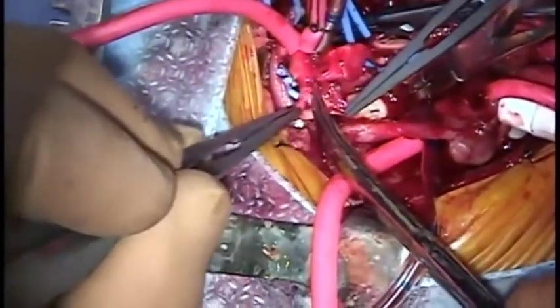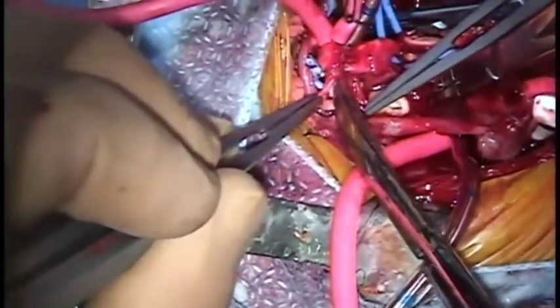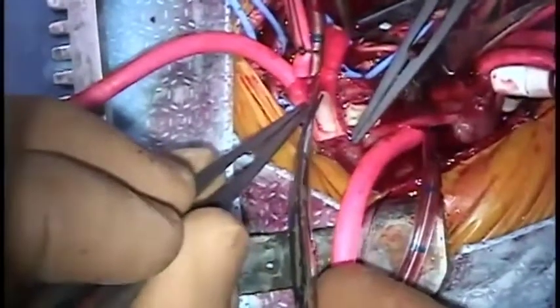The aortic arch is incised using scissors. More tissue is left posteriorly so that on the back wall of the arch reconstruction there will be native tissue anastomosed to native tissue.